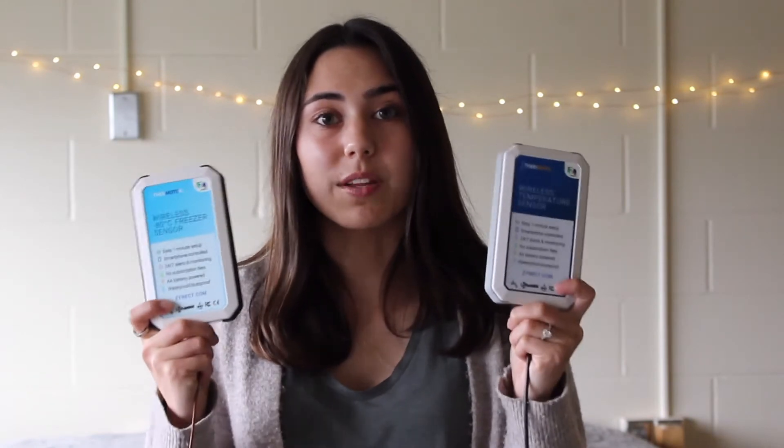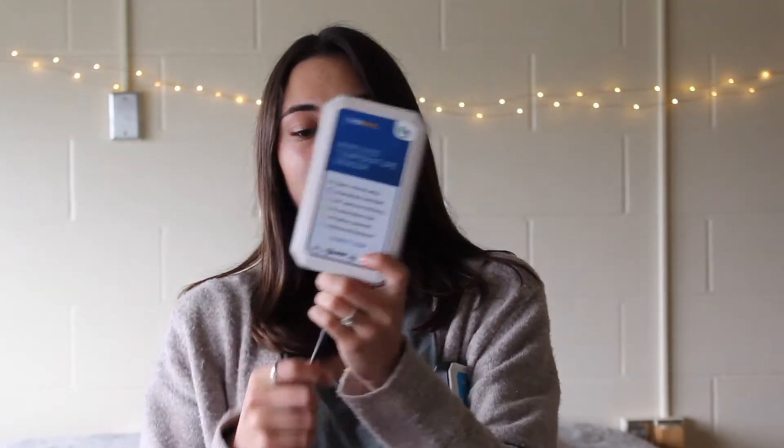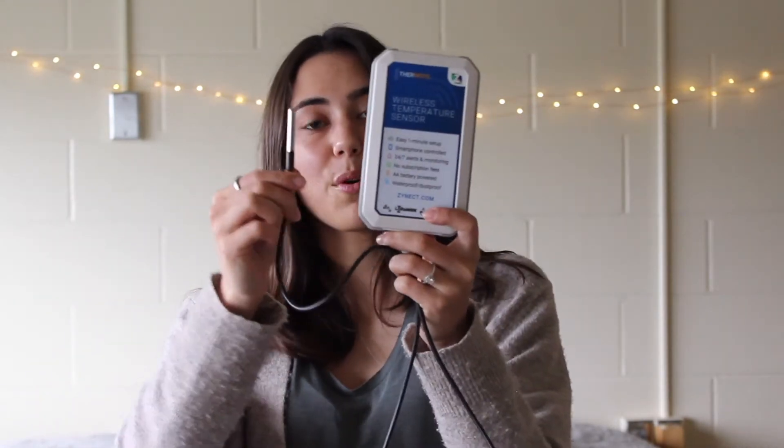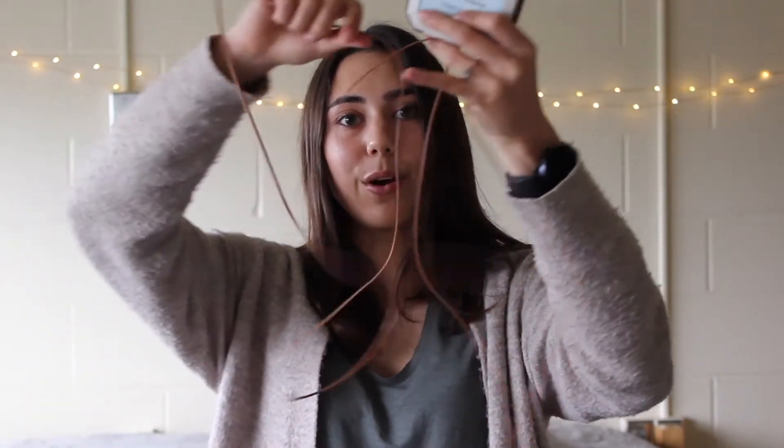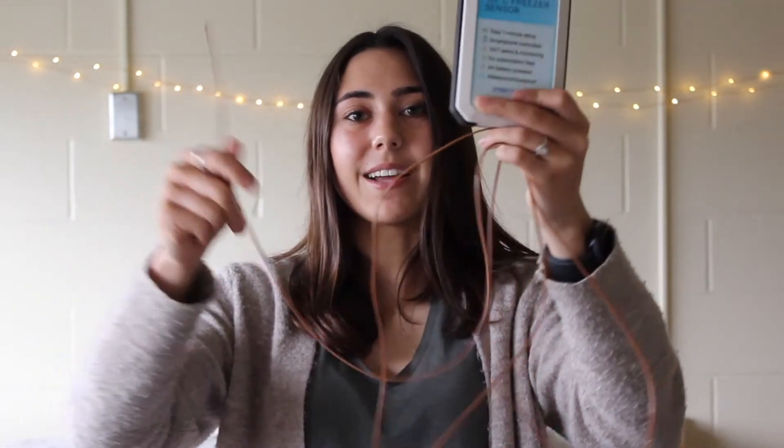Now I briefly wanted to compare the Thermo X to the Thermo, which I have right here. Appearance-wise they look quite similar, but a difference in their appearance is with their probes. The Thermo here has a nice durable black cord and a metal probe. With the Thermo X, you can see that the probe is a different material and quite a bit longer, so you have a lot to work with.